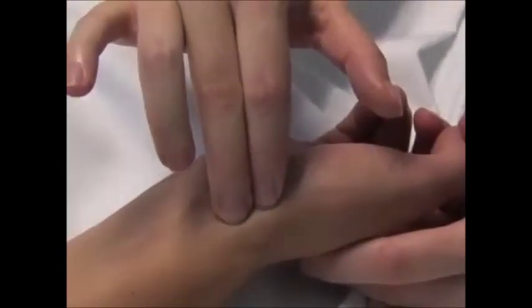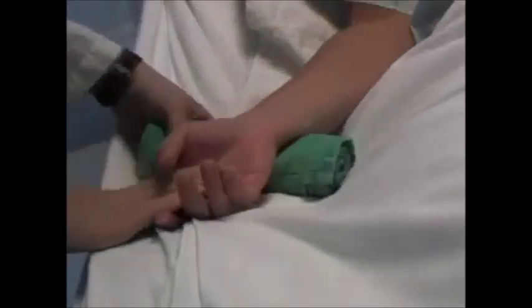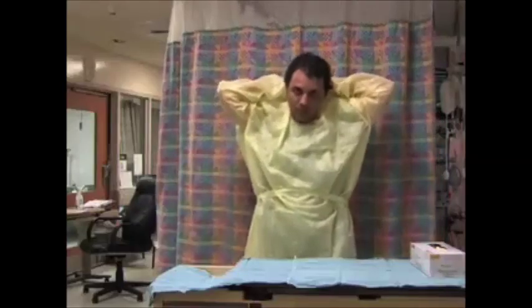The artery may be difficult to palpate, for example, in the presence of overlying edema or vasospasm. Extend the patient's wrist and place a rolled towel under it to maintain it in an extended position. Once the patient's wrist is positioned, put on a non-sterile gown and non-sterile gloves.